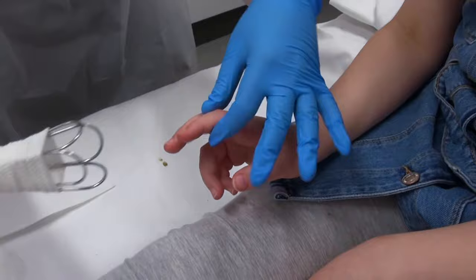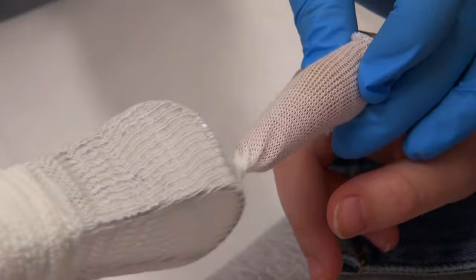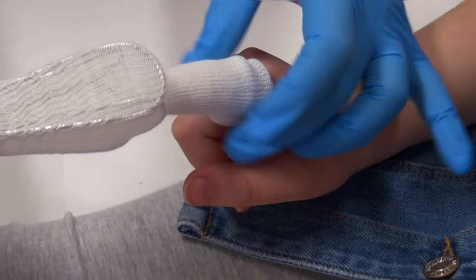Just hold the top of the cradle, then use your index finger and pop it on. Push down the bandage. Make sure you hold the top and the bottom bit. And then just twizzle the top and then feed it back through. Make sure you're keeping hold at the top and the bottom. And then twizzle it a couple of times.